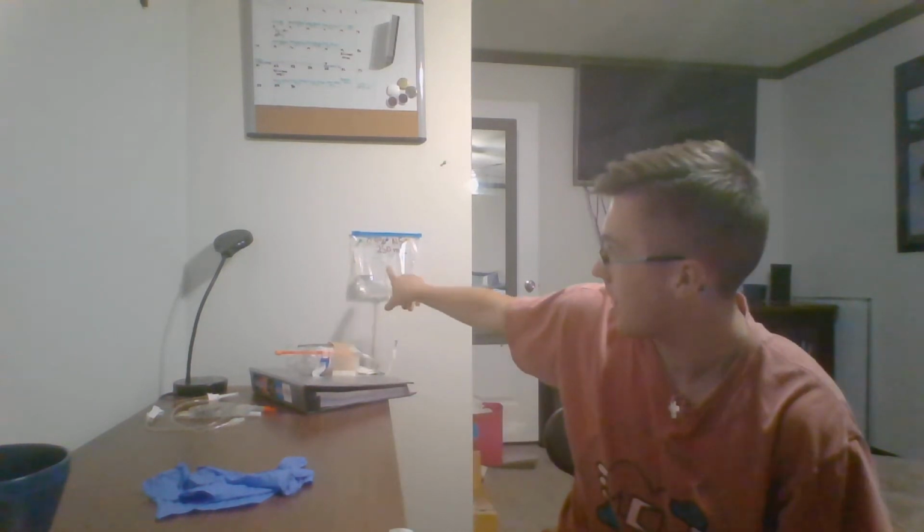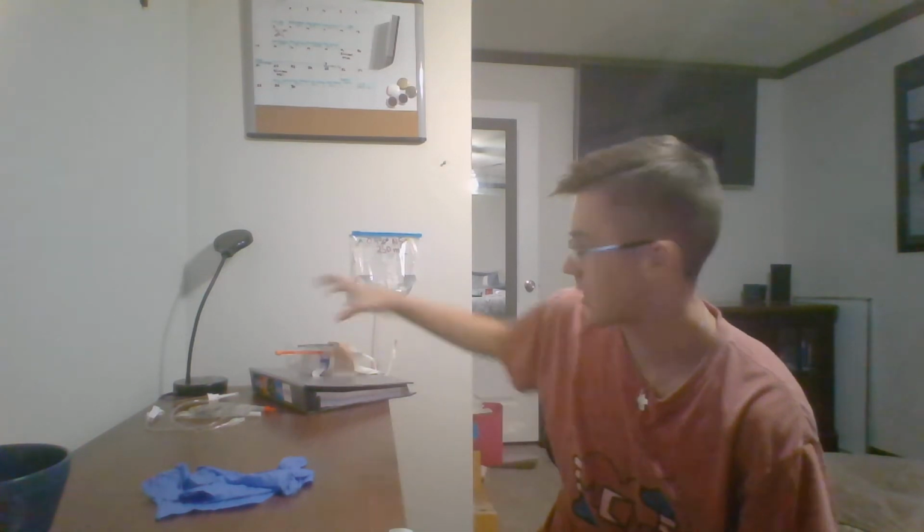Before I begin, for here consecutive throughout my next 5 attempts, I will be using my at-home administration sets that I've built. So back here I have a 250 ml bag of 0.9% normal saline with a Y port, and it's currently attached to my at-home made arm vein. Due to COVID, I haven't had a whole lot of time to be able to get into the lab. That's why I've had to make these things at home.